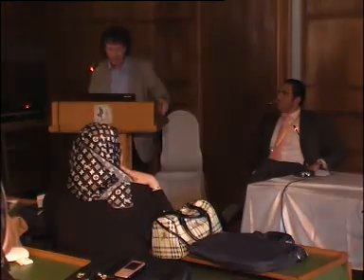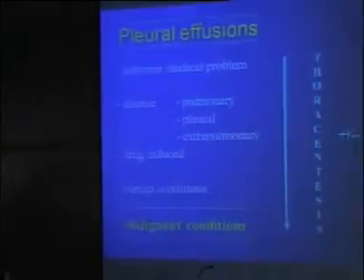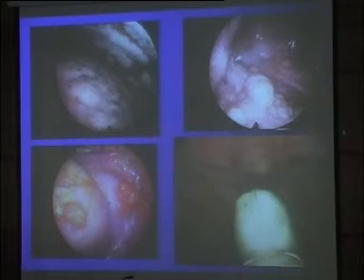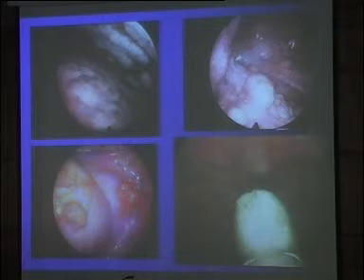Yes, like this one, for instance. Here I take the lung, but you can also take the parietal pleura in the same way. She's asking about the distance between the two ports in this case, and also the direction. Can I put one opposite the other or in the same direction? It's a good question. And according to the size of the lesion, where can I put the telescope and the trocar?